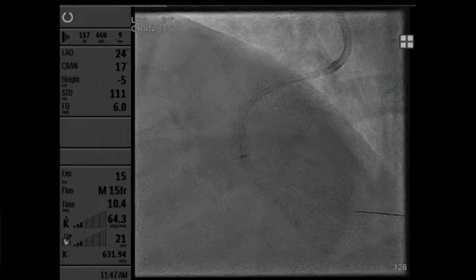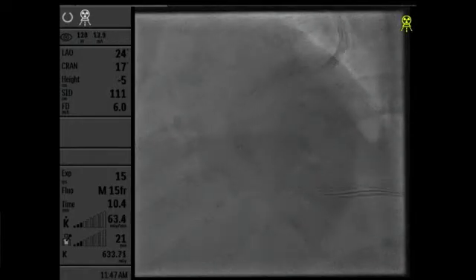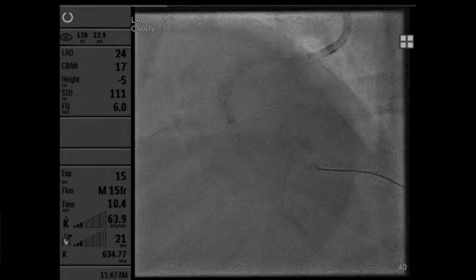With the discussion about eccentric, nodular, concentric. Can I have the shockwave again? The experience is that with the eccentric in the peripherals, as Hader was describing, you don't seem to see much modification.